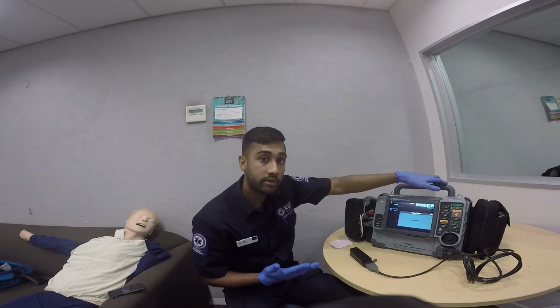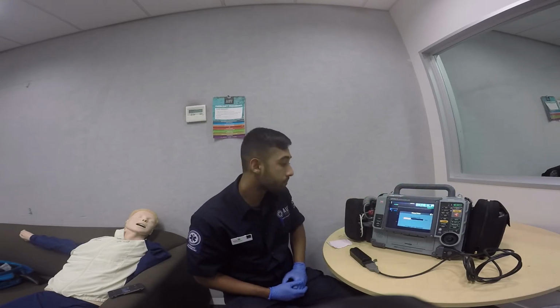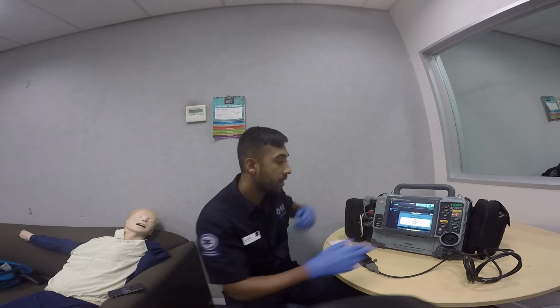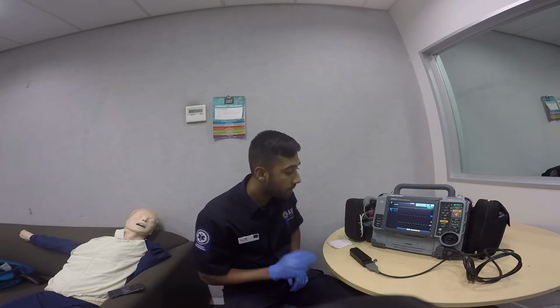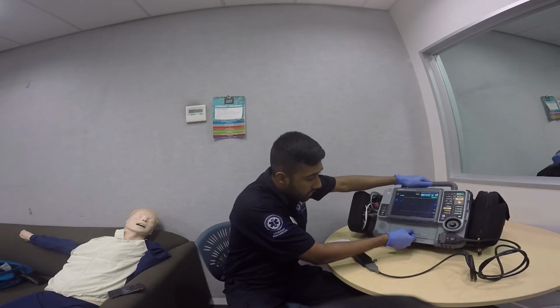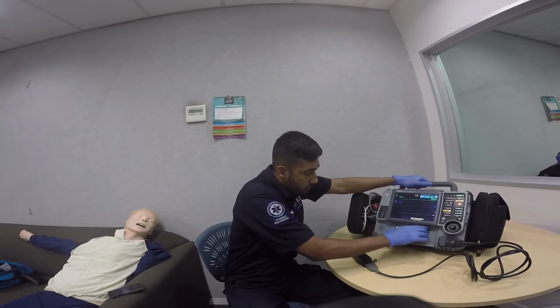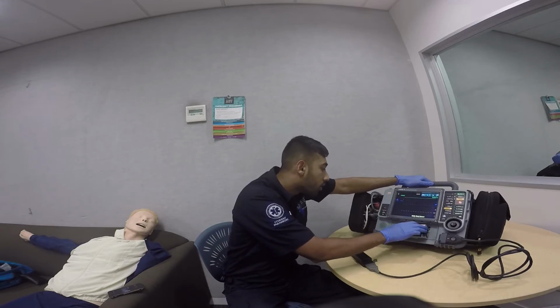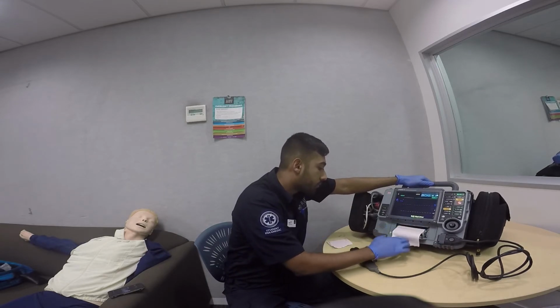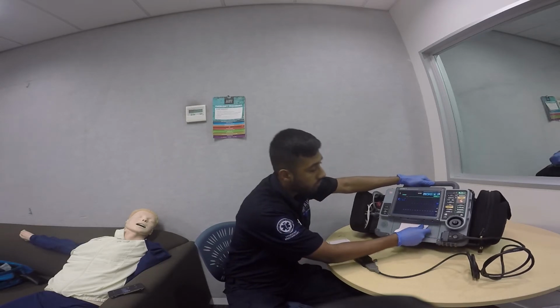And if you want to disarm the charge while you've done it, you hit charge again, and you can hit the speed dial and the charge is disarmed. You can also check for paper from this flap below, ensuring it's full, and you can just close this tab like so.